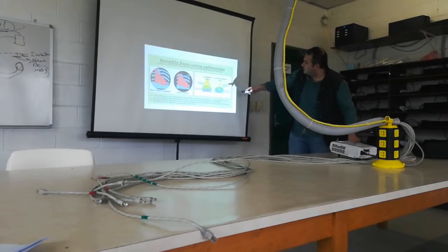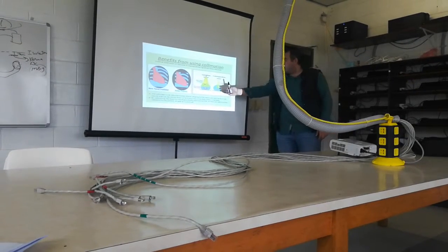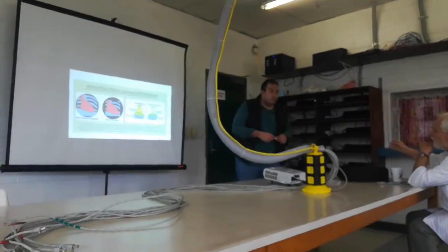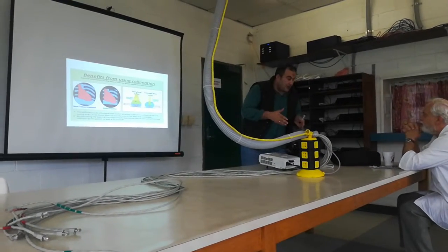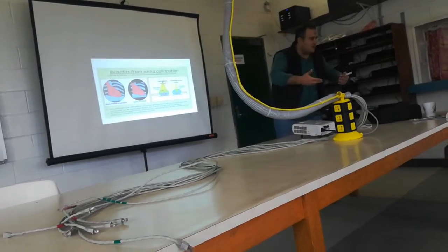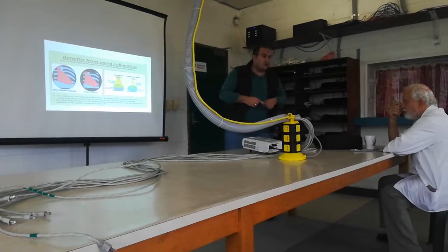Here you will find an example for open beam and collimated beam. What's the difference between open beam and collimated beam? Here less dose, here higher dose. Collimation doesn't change absorption, but definitely, if you reduce the collimation, it also reduces scatter, because the interaction of photons with other parts of the organ will be decreased. So scattered radiation also will be reduced.